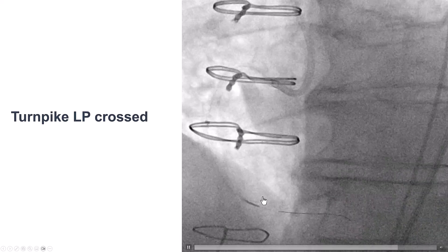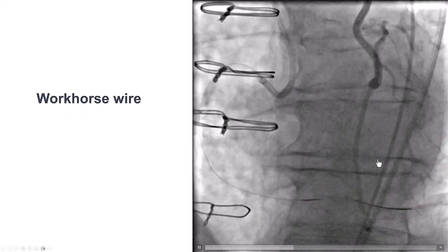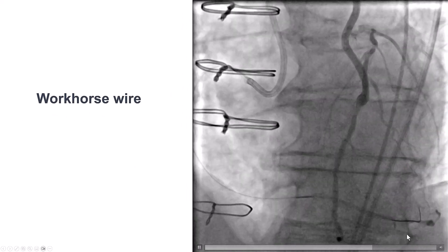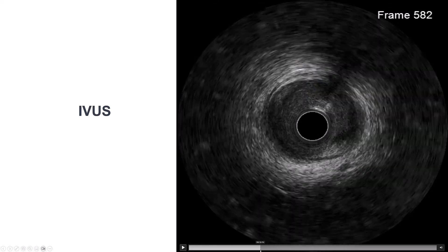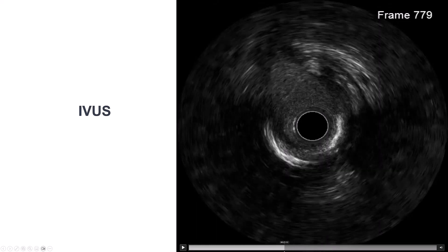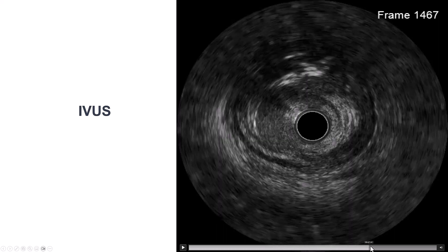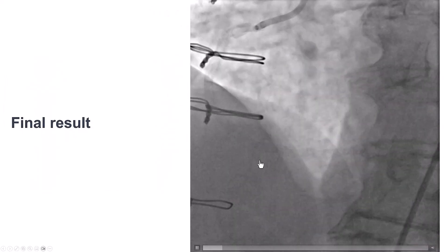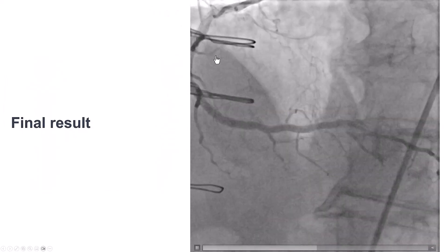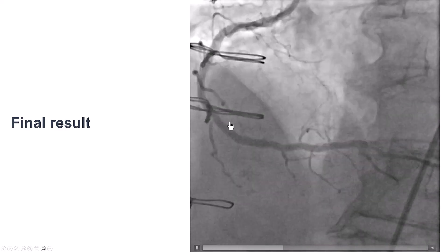We then exchanged the guidewire for a workhorse guidewire and were ready to perform percutaneous coronary intervention. We performed intravascular ultrasound, which showed significant calcification on the vessel but also a lot of soft plaque. We predilated — the balloons expanded well — placed stents, and got a nice result with TIMI flow all the way to the distal right coronary artery.